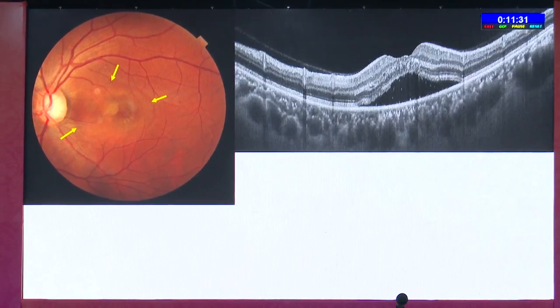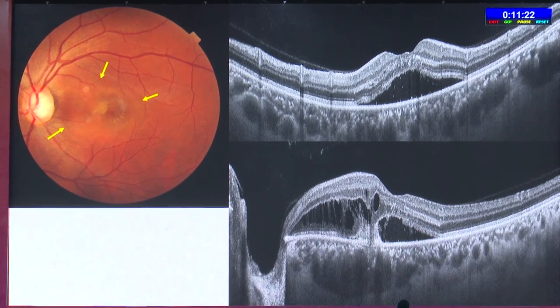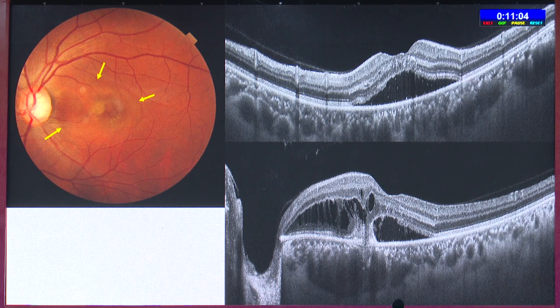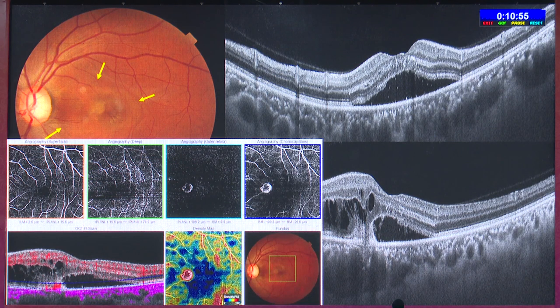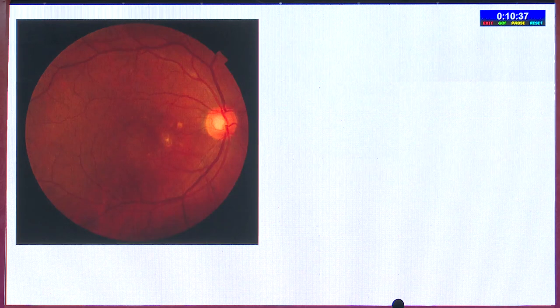A 25-year-old male presented with diminution of vision, a neurosensory detachment involving the fovea and extending almost to the optic disc — initially looking like CSC on OCT. On another section, outer retinal cystic cavities were visible suggesting optic disc maculopathy, and a hyperreflective breach of the RPE was visible — corresponding to a membrane on re-examination of the fundus. This was confirmed as CNVM on OCTA, which picked up the high-flow membrane that was initially missed. The patient responded to anti-VEGF with decrease in fluid and improvement of vision. A simple case of CNVM can mimic CSC.